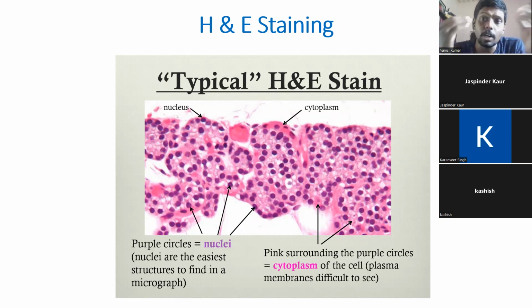If proteins are coagulated, fine, the morphological structure doesn't alter, but we are missing some key features in the tissue which are not visible to the naked eye. Classical histopathology only helps us with surface knowledge of cells and their arrangement and architecture.